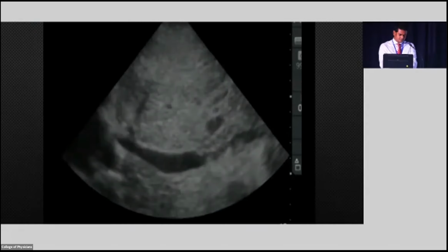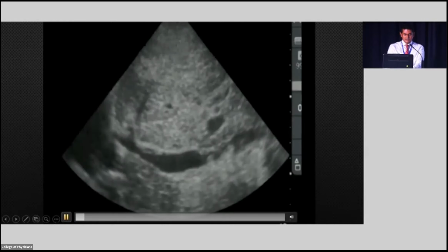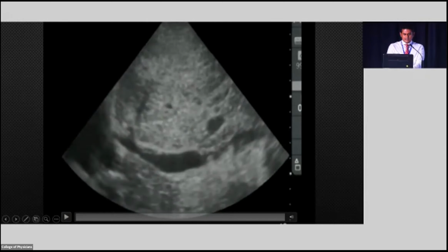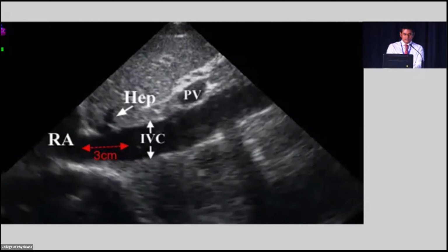So then further going into the inferior vena cava, if you see the inferior vena cava, you classically see the IVC collapsing. So definitely now with all these images, you can tell that the patient is going to be fluid responsive. Now I would like to tell something about assessing IVC, which is a highly debatable topic when it comes to fluid responsiveness.